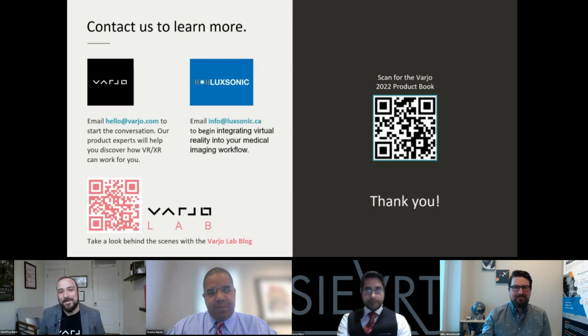Yeah, thanks. Having worked in VR hardware now for almost 10 years, and having demoed lots of people on different headsets with different images, I think there are a few things Varjo does that add to this. The most important one is that we have an automatic IPD adjustment. That's actually why the eye tracker was originally built: to mechanically actuate the lenses to measure the proper interpupillary distance and adjust the lenses accordingly. Whether or not it's been explicitly stated, improper adjustment has led to a lot of eye fatigue and simulator sickness.